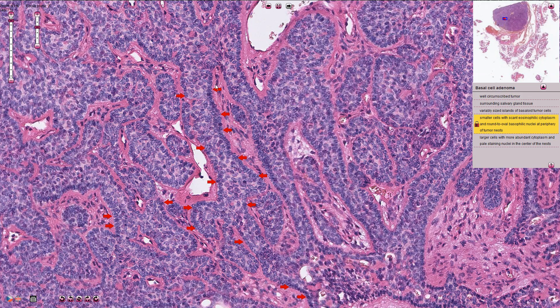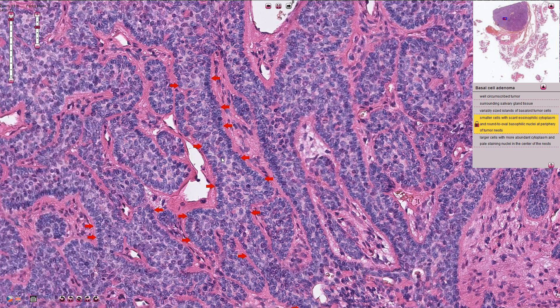On higher magnification we can see the detail of the trabecular pattern of growth, and we see that these trabecular structures are composed of two types of cells.